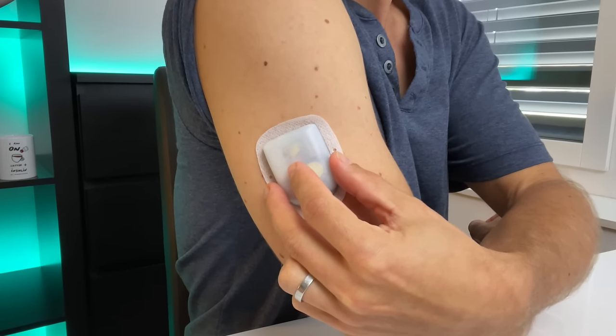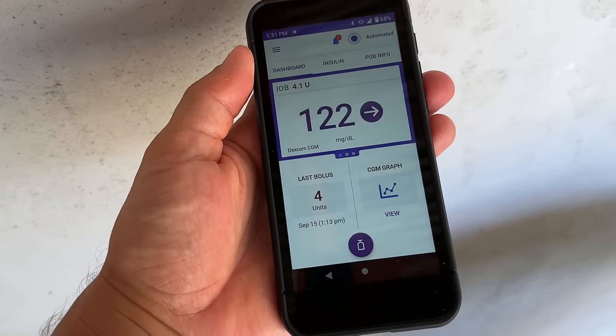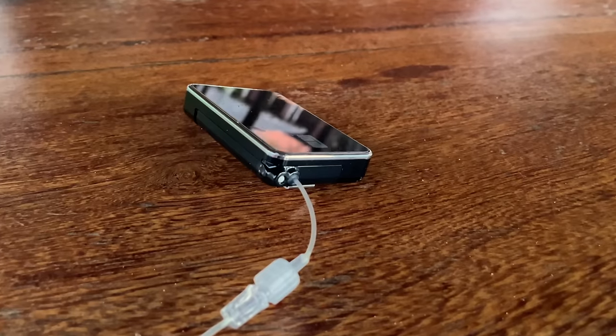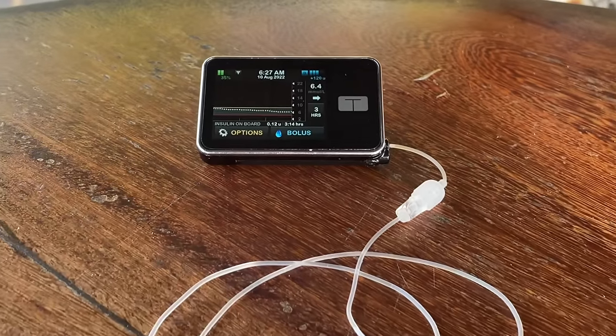What's great about both the Omnipod 5 and the T-Slim X2 is that each has an algorithm which works with a continuous glucose monitor and can automatically adjust your insulin dose based on your blood glucose levels. We'll talk about the algorithms in a minute, but first let's look at how these two pumps look and feel.